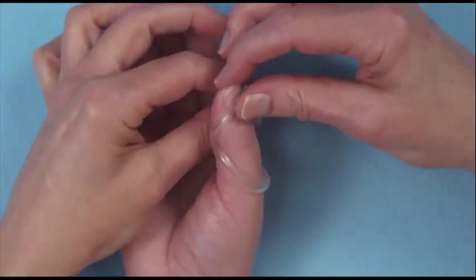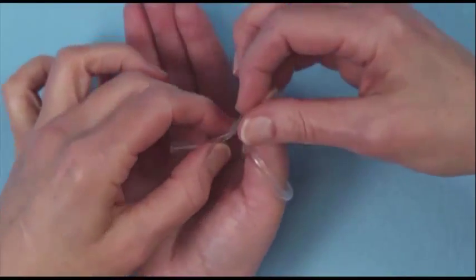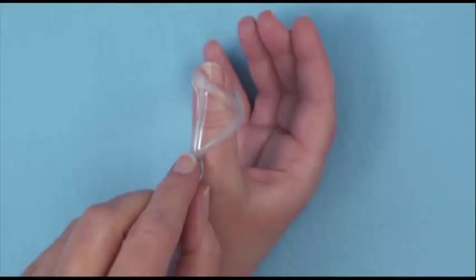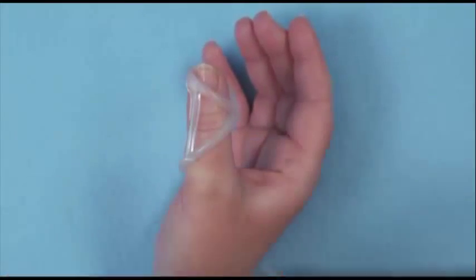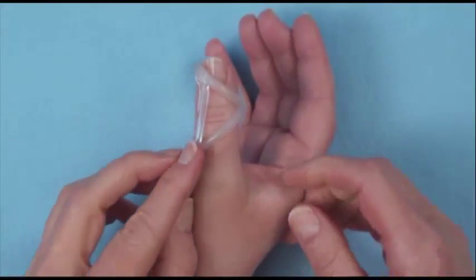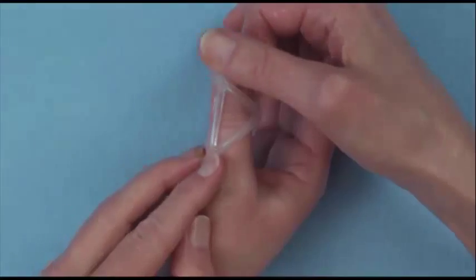Dorsally around the fingernail before joining the material together on the volar aspect. Take a warm piece of dry splinting material or tubing and dry heat the ends with a heat gun and apply to the splint, applying pressure as you do this to bond the material together.